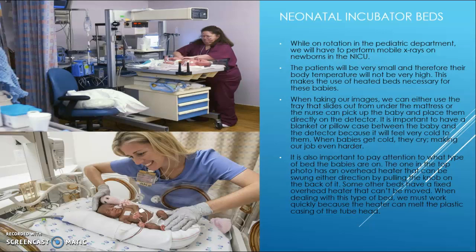And last we have the neonatal incubator beds. We see these when we're doing portables in the PD rotation down in the NICU. These patients will be very small, therefore their body temperature will not be high. This makes the use of heated beds necessary for them. When taking our images, we can either use the tray that slides out from under the mattress, or the nurse can pick up the baby and place them on the detector.